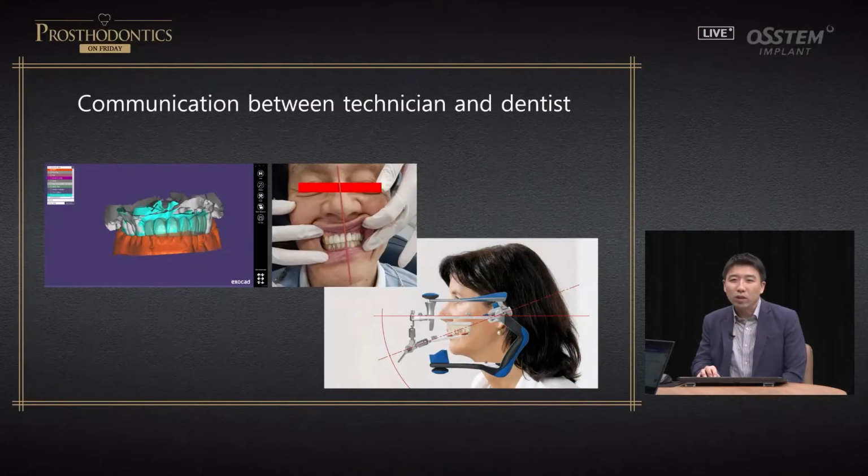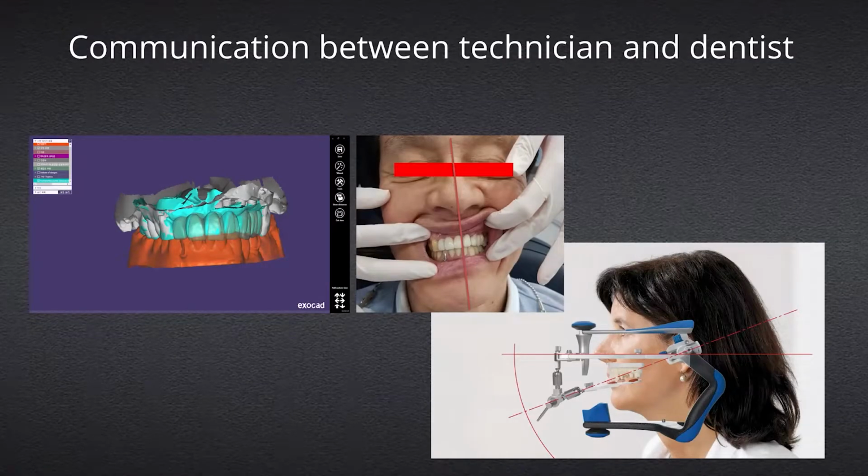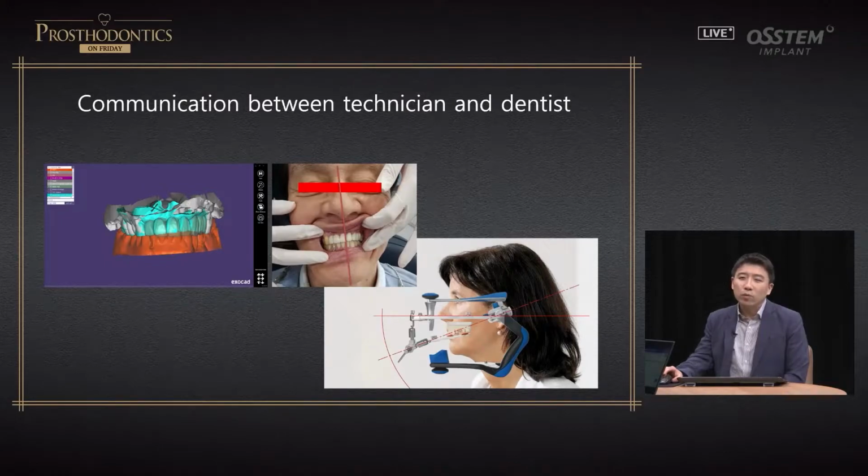In this case, the facial scan data can be used in different ways. If you look at this patient, the facial midline and teeth are quite apart. You need to consider this. If you only deliver oral information to the lab, there are going to be many challenges for the lab technician. In communicating with lab technicians, sending facial scan data would be of great help. I believe this is something that needs to be delivered.